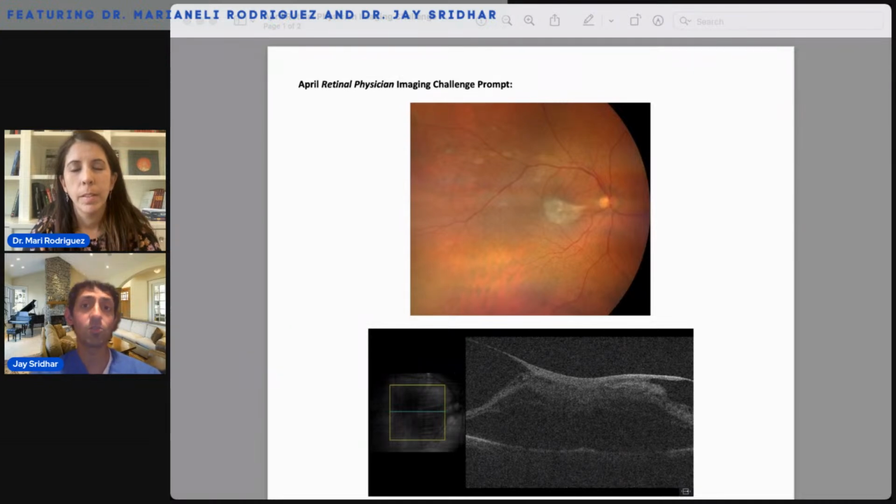I probably would induce the PVD without any stain, because I don't like to use Kenalog if I'm going to stain with a vital dye, because sometimes it obscures the contrast. So I'd probably lift the hyaloid, then restain. The nice thing when you have vitreous macular traction with an ERM, a lot of times when you lift the hyaloid, it actually fractures the ILM or the ERM.